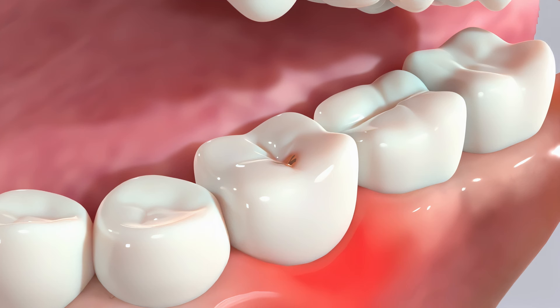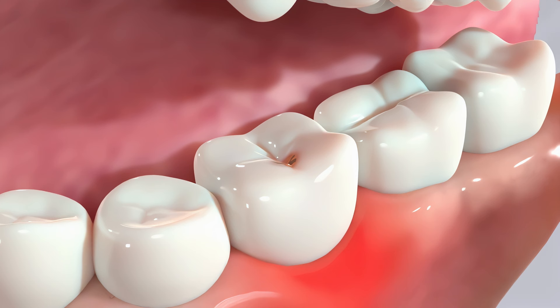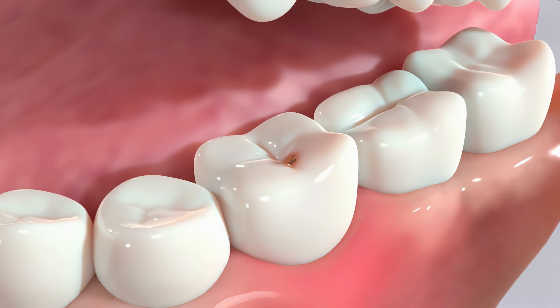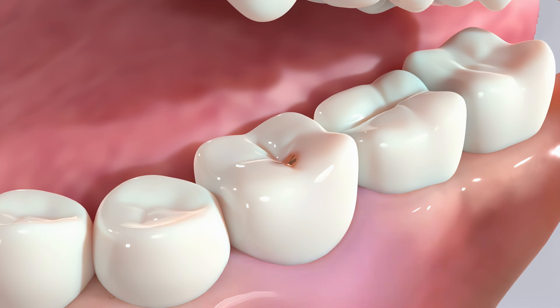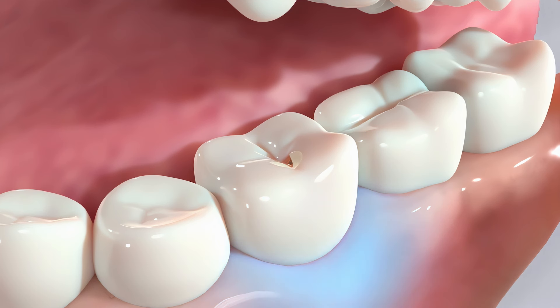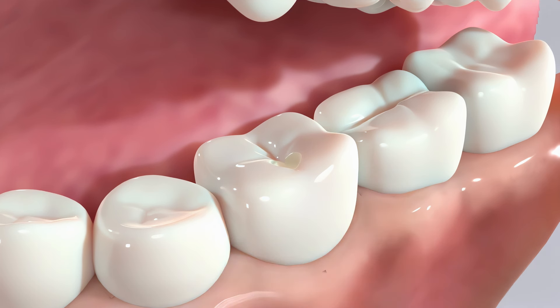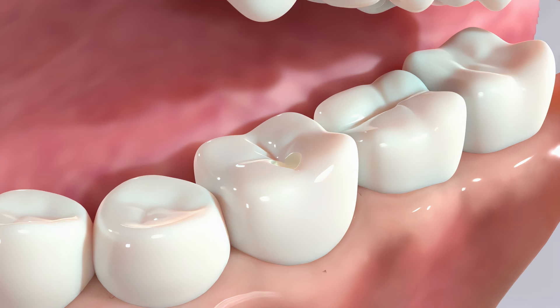Your dentist can treat small cavities with dental fillings to restore the shape and function of your tooth. Your dentist will begin by numbing the area around the tooth for a more comfortable experience, then remove the decayed tooth structure. The tooth is now prepared to be filled with a composite material.